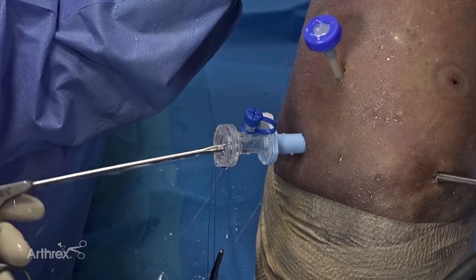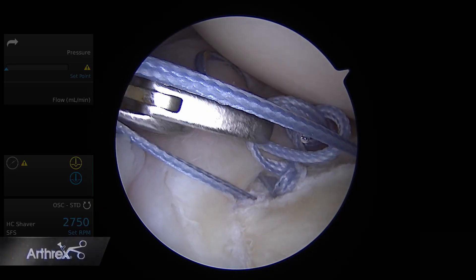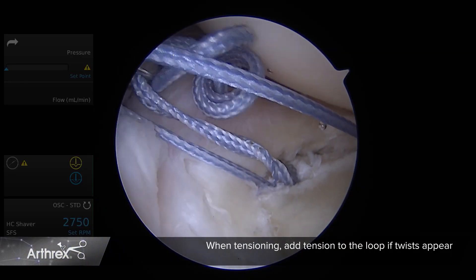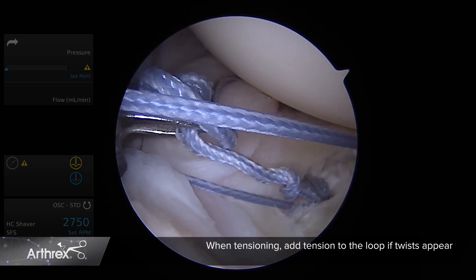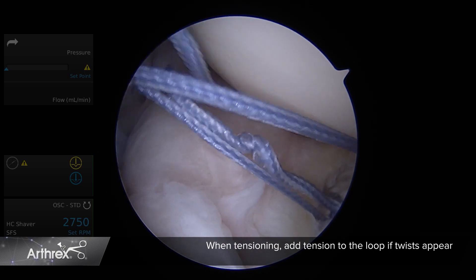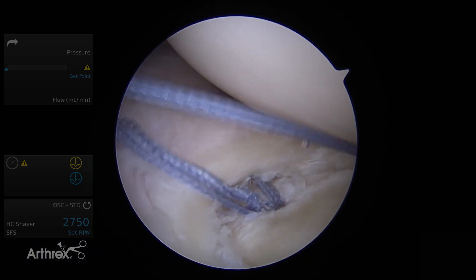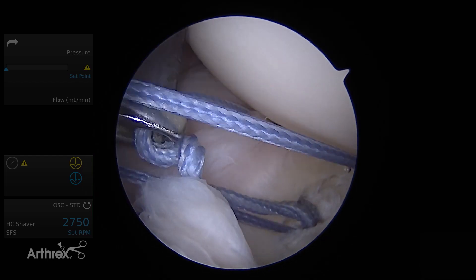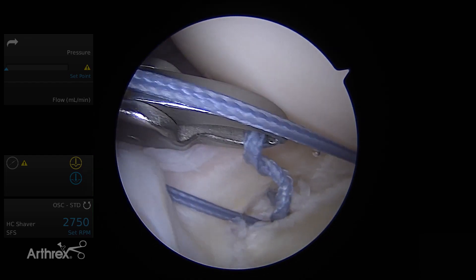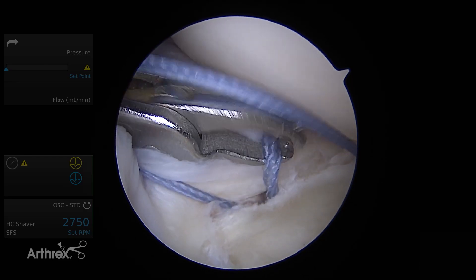If you happen to have a twist or tangles in your loop, don't panic — I want to show you how to stay out of trouble. Here you see our 7 o'clock anchor that has a slight tangle. The key is adding tension to the loop with a ring grasper. This gentle tension allows the repair stitch to slide easily through the anchor without placing undue force across the anchor or the labrum. Being patient during this process is important, as you want to take the slack off the suture but allow it to gently slide through the anchor.